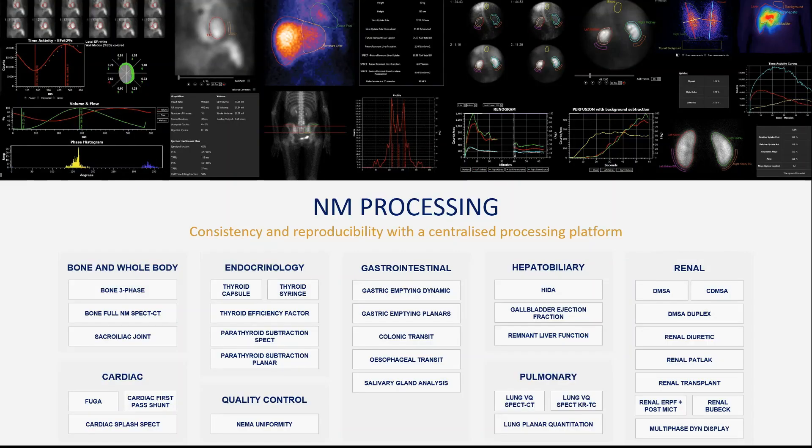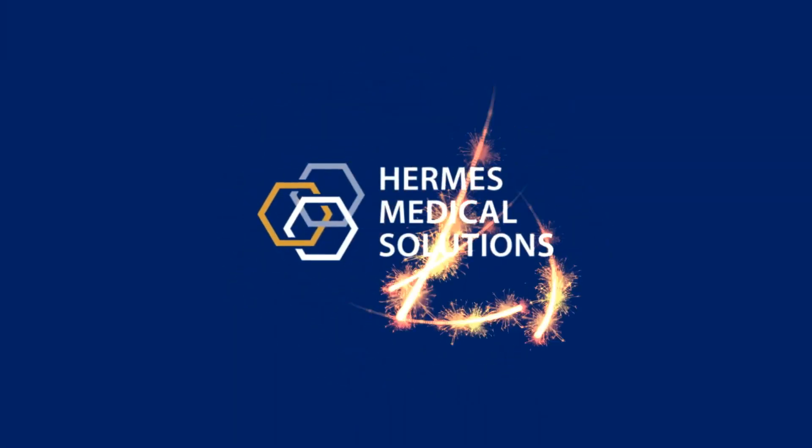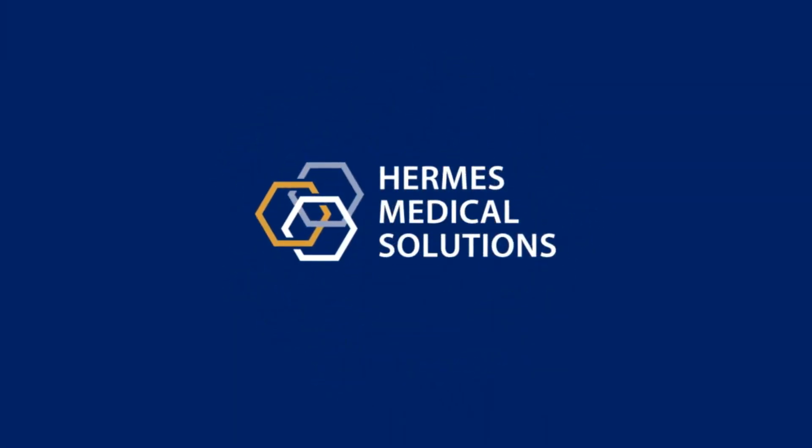That was a very brief overview of the nuclear medicine processing applications from Hermes Medical Solutions.